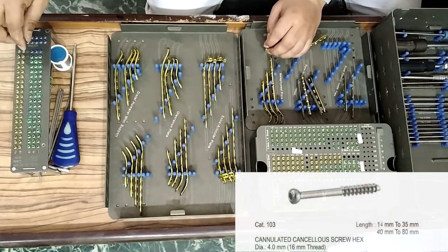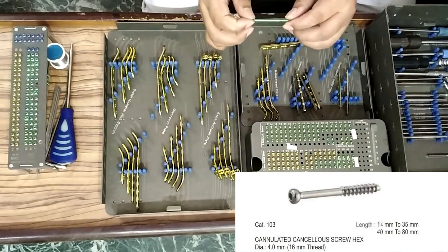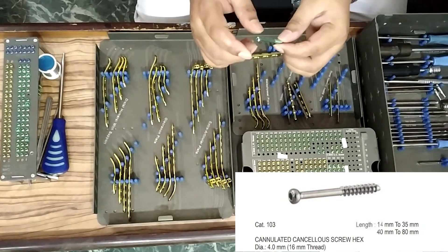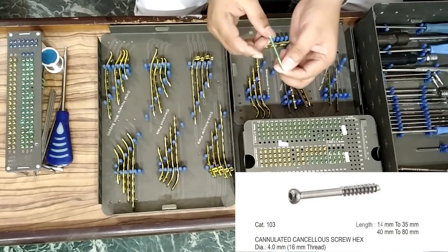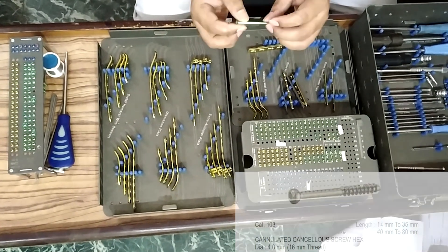4 mm cancellous screw, 28 mm to 80 mm, two pieces each. From 30 mm the gap will be 5 mm.